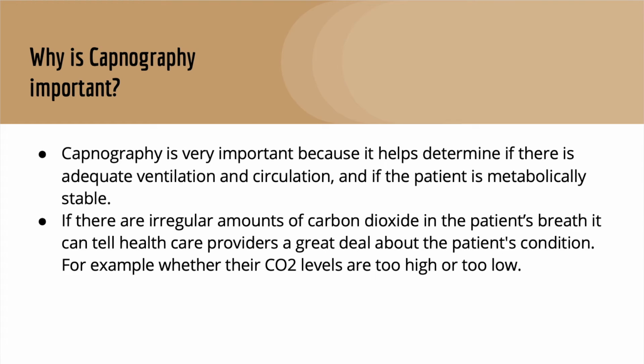So why is capnography important? Well, it's important for a lot of reasons, but the number one reason is because it allows a provider to differentiate between sick versus not sick. It can determine whether there's adequate ventilation and circulation, and it's a non-invasive way that we can determine this. We don't need any kind of invasive equipment to determine whether a patient is adequately ventilating and circulating oxygen throughout their body. And it also will help us determine if a patient is metabolically stable.